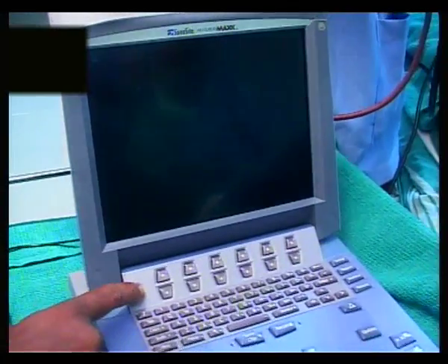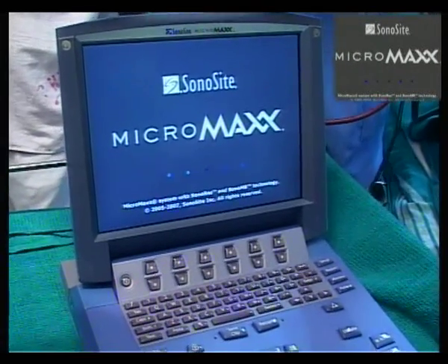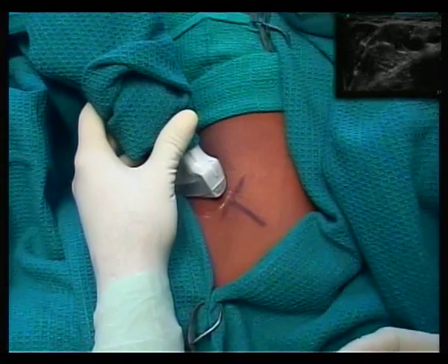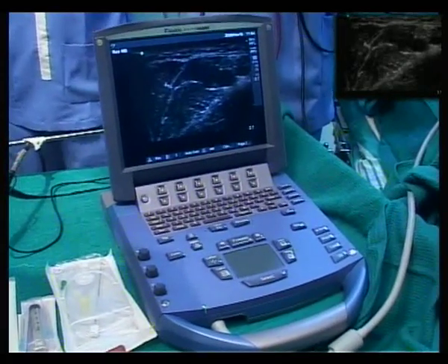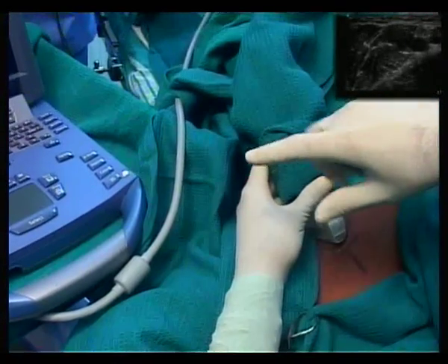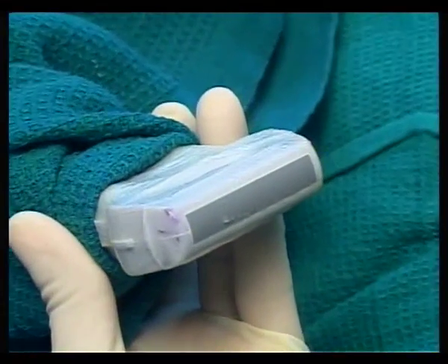What I'm holding in my hand is the transducer probe and the transducer head. This is the heart of the machine — the entire box you see here is just a computer. Eighty percent of the cost of the machine is the transducer probe, and it depends on which transducer probe you use for what type of block.